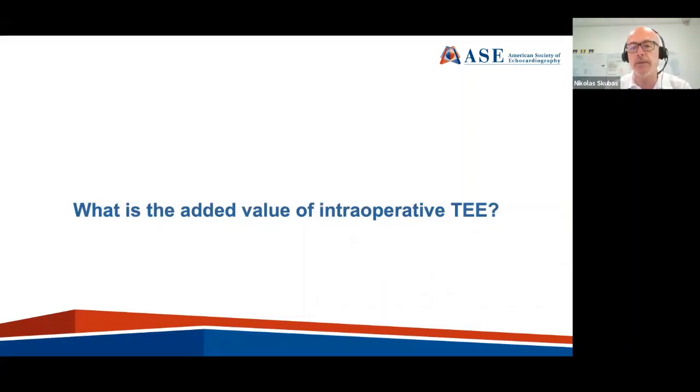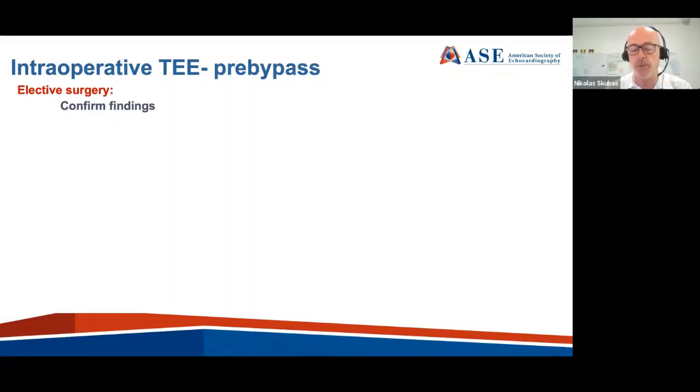So the next big item that we try to address in these guidelines is why one will bother to perform intraoperative TEE. It's very easy to believe in that from those who do it at all times, but for those who have questions, what is the added benefit of performing TEE before bypass? First and foremost, the patients do have a previous diagnosis, and most of the times we're dealing with elective cases. It is the purpose of the pre-bypass exam to confirm the diagnosis and make sure that nothing else has been added or has been missed or has changed since the case was booked.